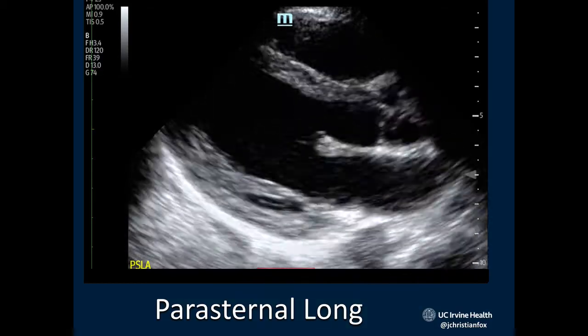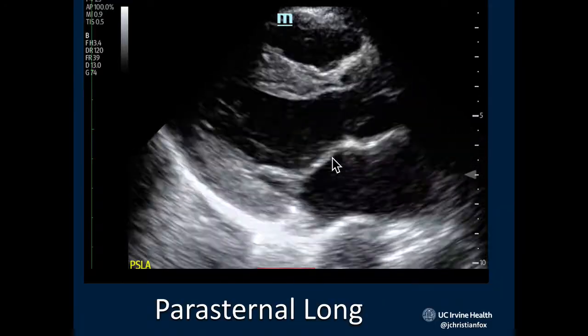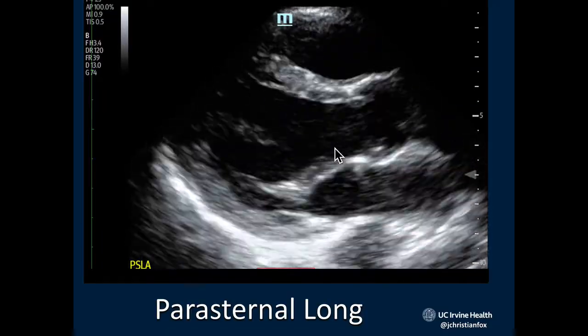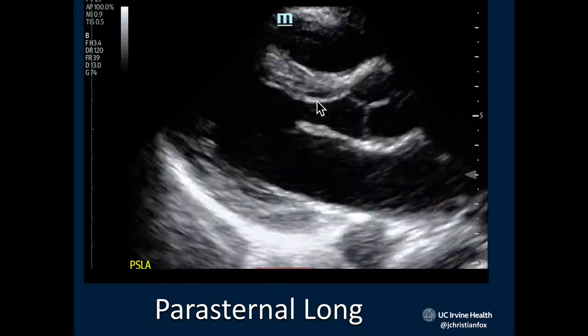All right, here we see the parasternal long axis. We see the left atrium. And during diastole, the blood flows into the left ventricle, goes through that mitral valve, and that mitral valve comes up and smacks into that septum right there. You can see it. Bam, bam, bam. Who's your mitral valve? You see that, how it smacks that septum? That's normal. That's what you want to see.